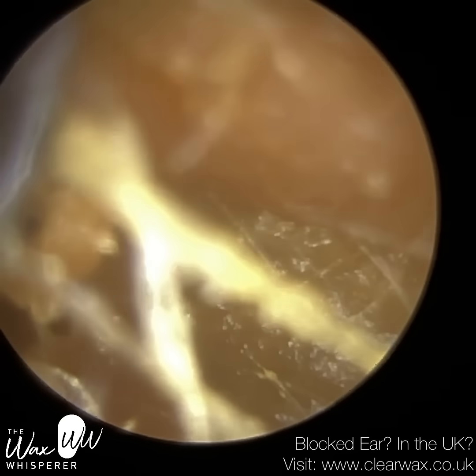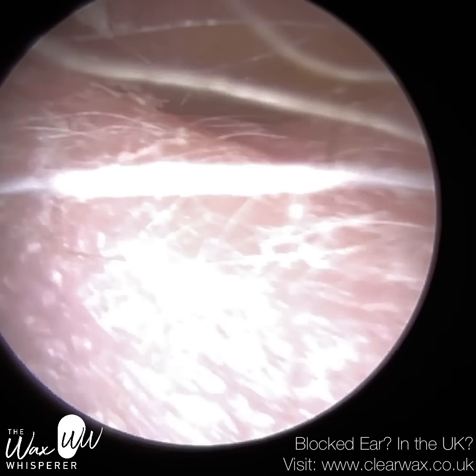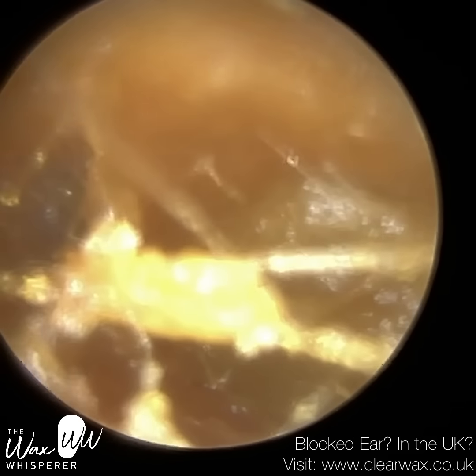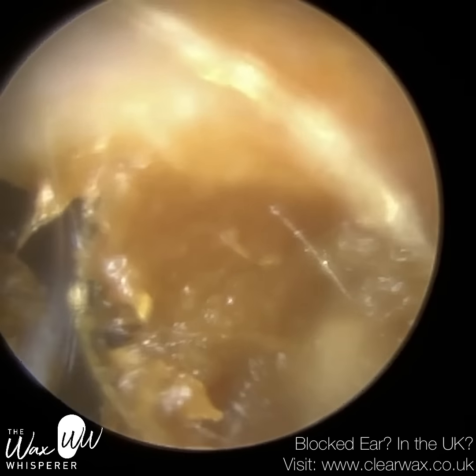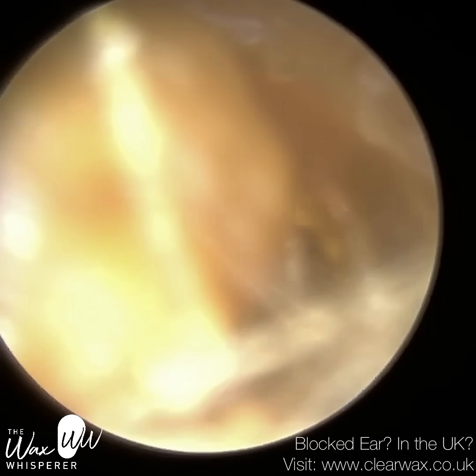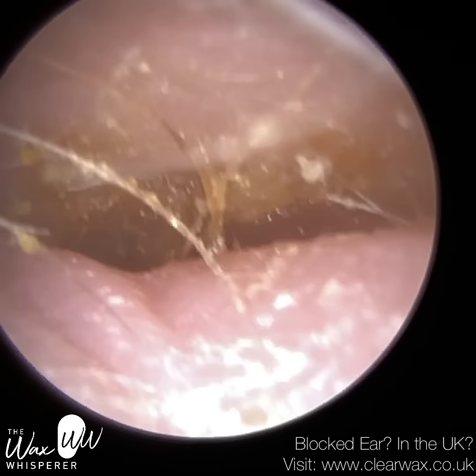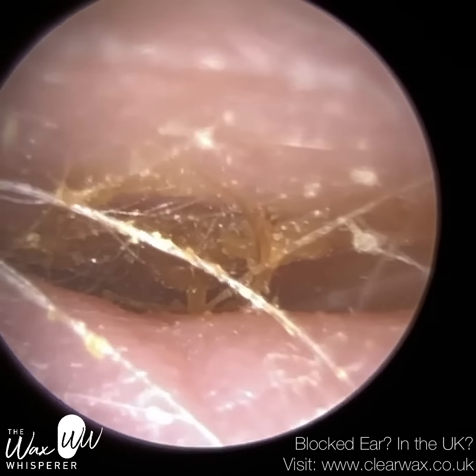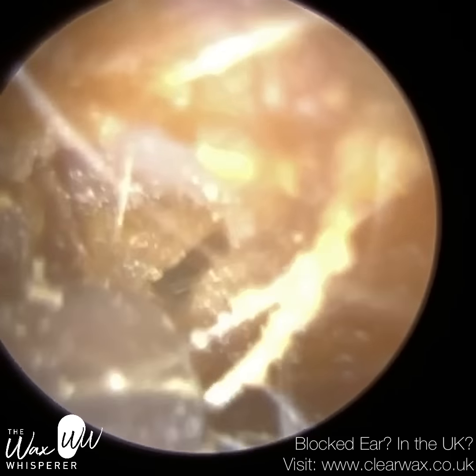I'm just commencing with the right ear — this is the ear they felt was the worst of the two. As you can see with the Zollner Suction Pro, where we're performing microsuction, it's not coming out in big pieces. Indeed, some of the soft wax blocked the inside of the suction probe. I've just seen an opportunity to try and scoop some of this wax out, and I've used the Jobson Horne. Although I did remove a little bit of earwax, it was not bringing out the whole entire mass. So I've reverted back to microsuction.